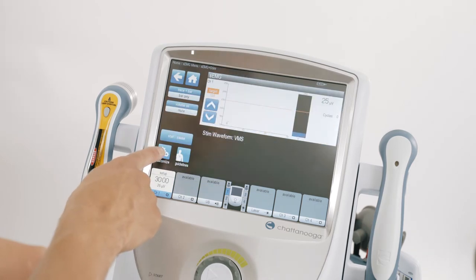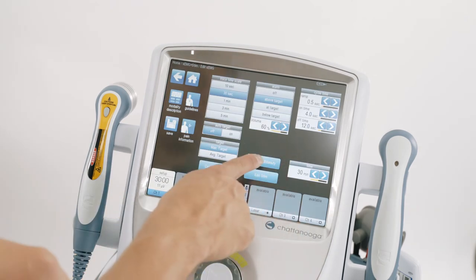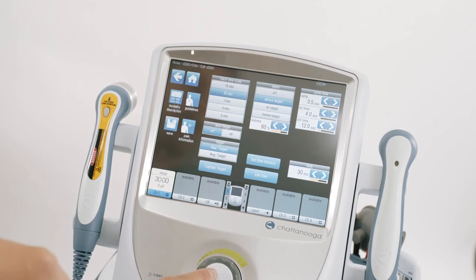The first step is to capture the target. The second step is to set the stim intensity. Increase the intensity until you see a visible muscle contraction in the patient. Press start to begin the treatment.